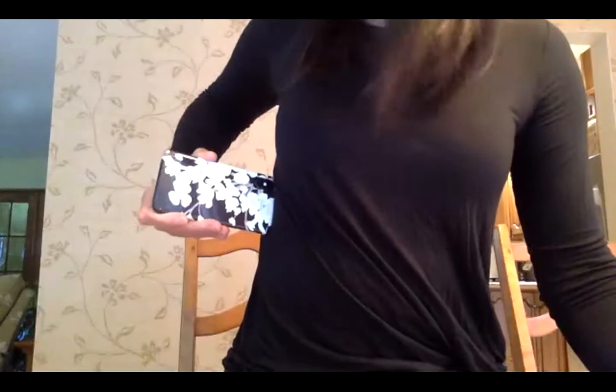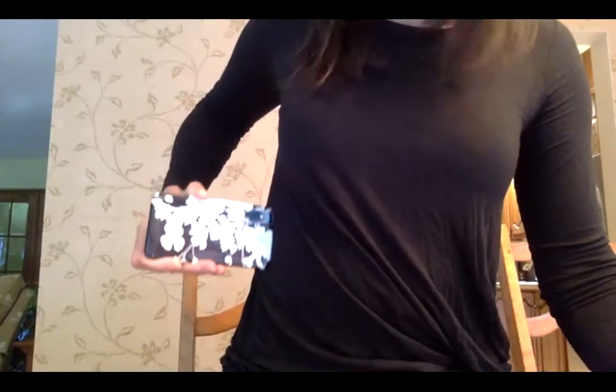So you do like a FAST. I don't even have anything. Oh, yeah, my phone. So that's the probe. You take the probe and you go just like a FAST. So right here, we're in the right upper quadrant, and you're going to slowly slide down like this until you hit about the iliac crest. And this is really where it's going to taper.